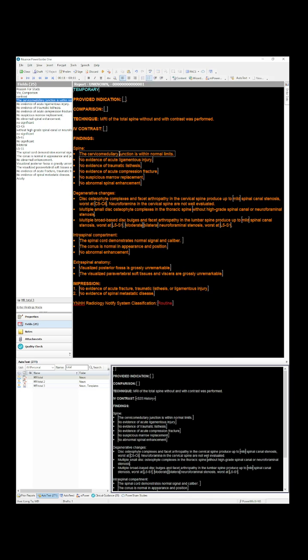Is there anything acute? Is there acute traumatic pathology? Is there anything concerning for suspicious marrow lesion? Is there any other spinal enhancement, right? And then what I found when I was a fellow and a junior attending, I usually said the same things.